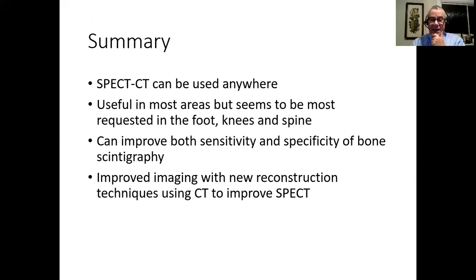So SPECT-CT can be useful anywhere. It's useful in most areas, but seems to be most requested in the foot, knees, and spine. I think it improves both sensitivity and specificity of bone scintigraphy. But these new techniques are really, I think, going to revolutionize it. I think within a decade, we'll find that we're all using these new techniques in terms of producing higher quality imaging.